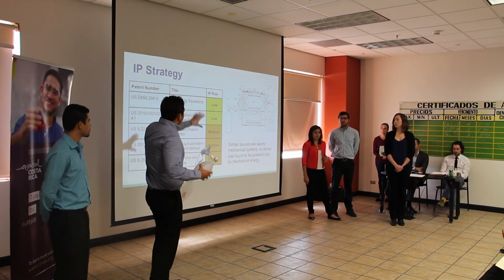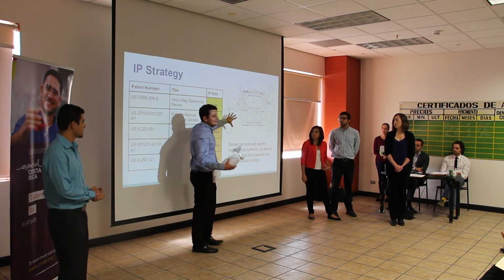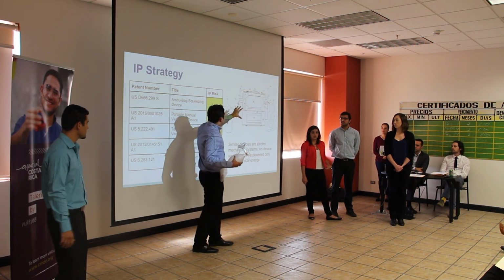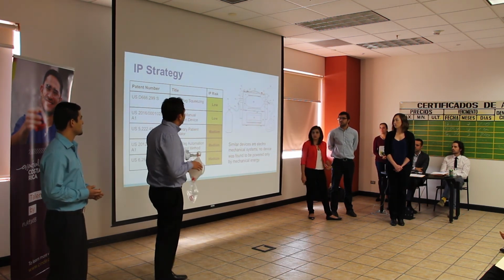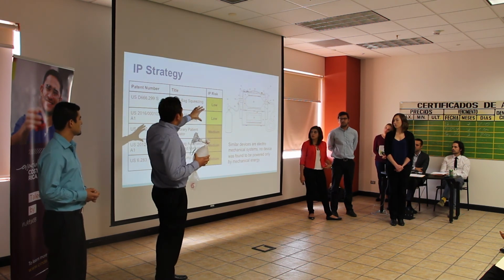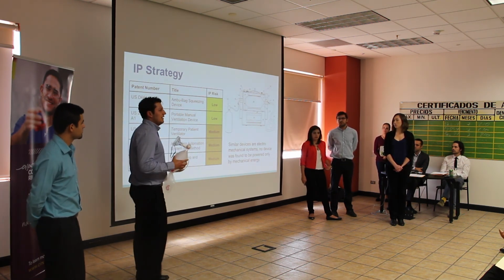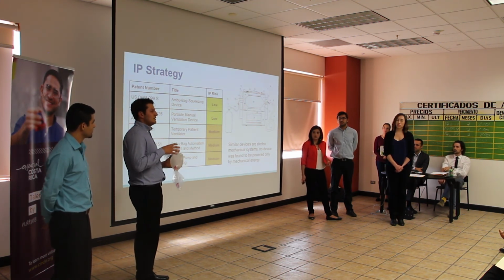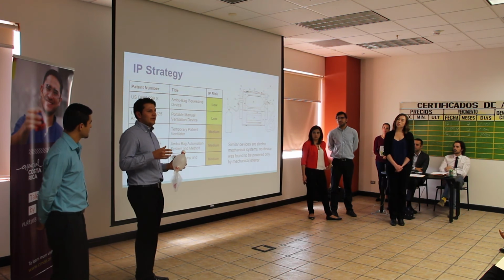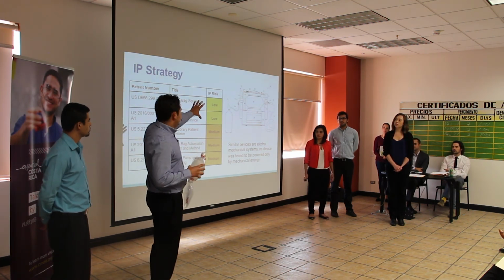And this one is an example. It must be placed on a table. It will have a tank, and it has a very complex electrical and electronic programming inside. So it's not affordable for every ambulance, for every clinic. So we think that if we make a mechanical device, only mechanical, it would be better for the places that cannot have the characteristics this equipment needs.